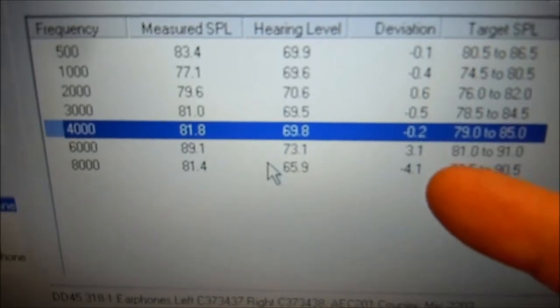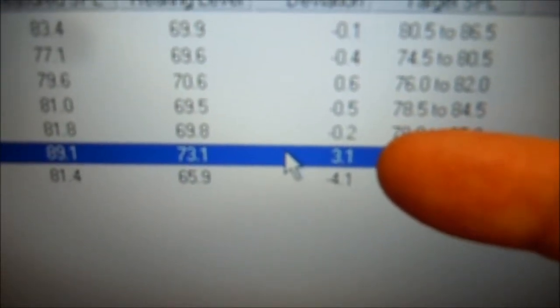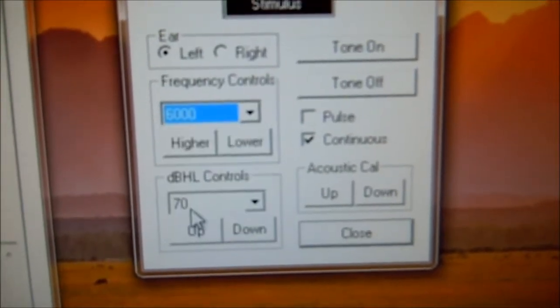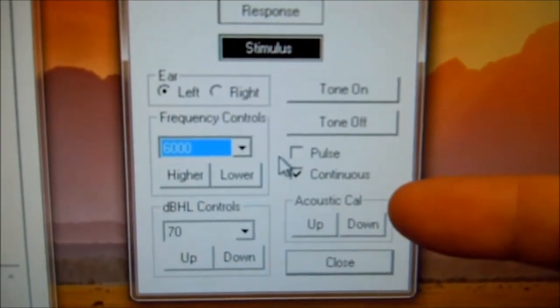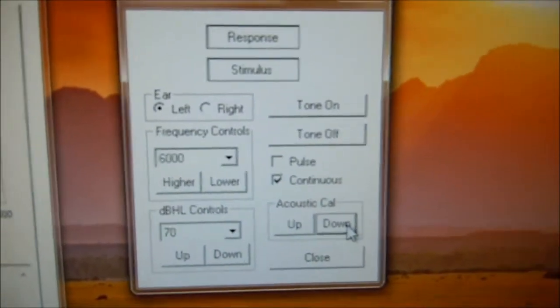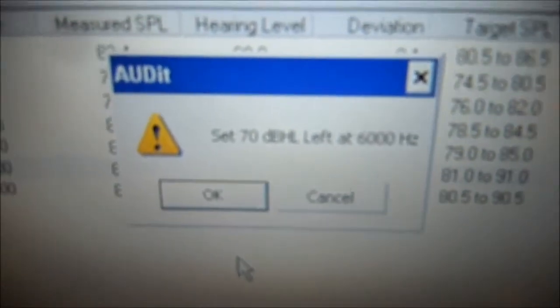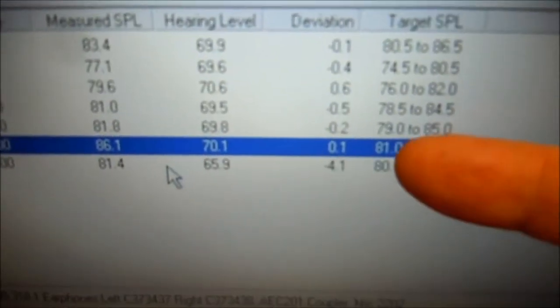And we're going to do the same thing for 6,000 and 8,000. Select 6,000 Hz here — notice this time it's positive 3, so that means we're going to go down 3. Come back over here to the audiometer, select 6,000 at 70 dB. Because this is a positive number — positive 3 — we're going to go down 3 clicks: 1, 2, 3. Come back and make sure our 6,000 is selected, click measure selected. It's going to ask at 70 dB, 6,000 — hit OK. It's re-measuring and we're near zero again — 0.1.